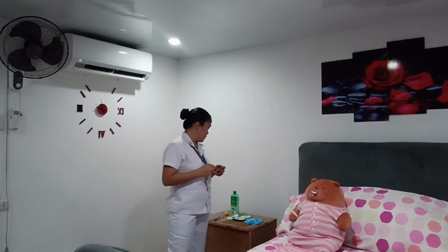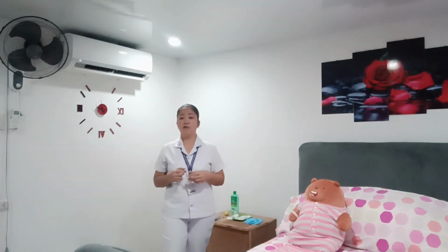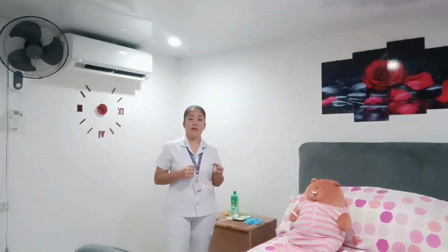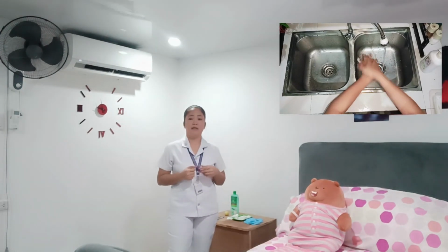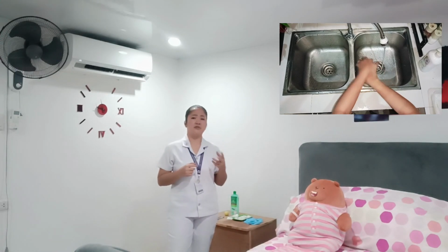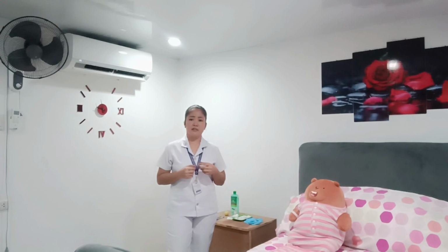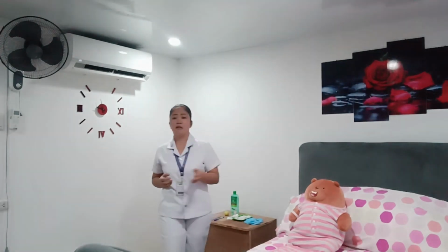And I also prepared vials here as my medication. I also got my gloves, and my book and my pen for the record. And I have alcohol for the hand hygiene. Okay? Now I'm going to perform my hand hygiene by simply washing my hands to avoid cross-contamination and even infection to my clients. I have my medication syringe ready, which I got here right on my side.